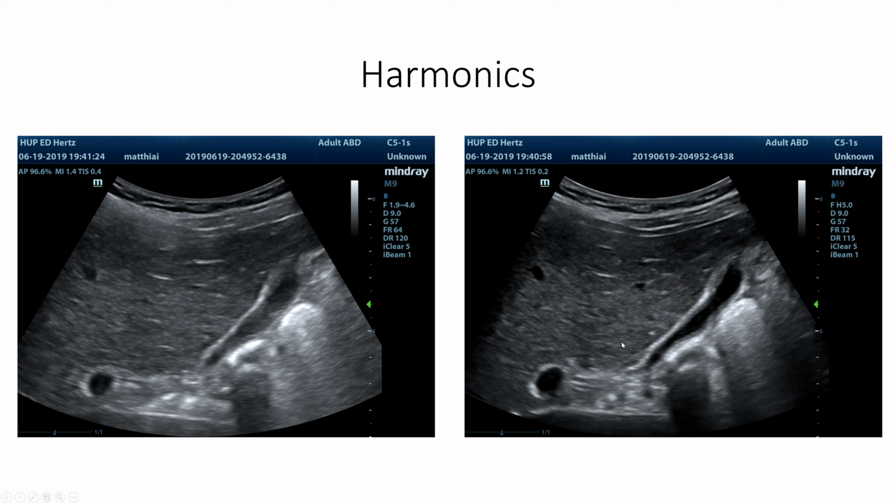And only the sound at the center of the sound beam is strong enough to generate a harmonic. As we were talking about a few slides ago in the focal zone slide, the real sound beam made by this ultrasound is not just a laser beam of sound coming directly straight down from the probe.